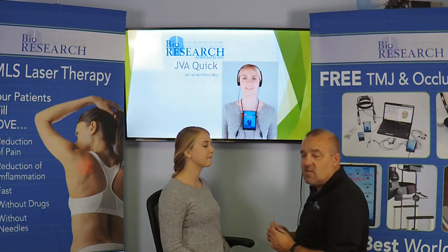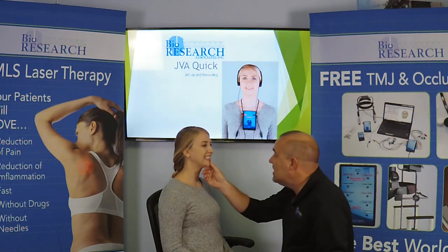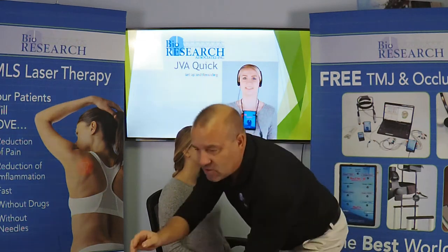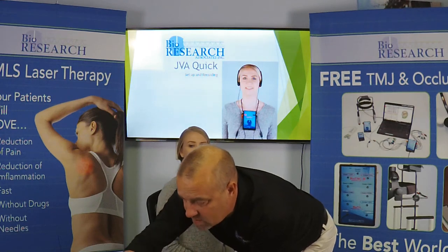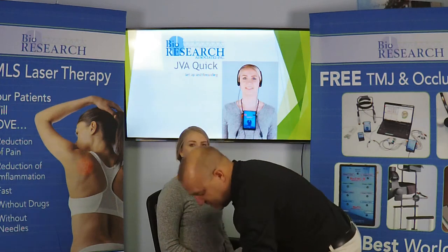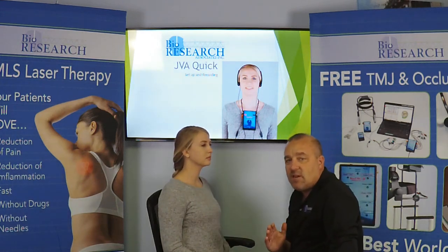Now, when we enter this number, we want to add the overbite or subtract an open bite. So bite, let me see her teeth. Okay, she's got about a 1 millimeter overbite. So I measured incisal edge to incisal edge of 62 plus 1 millimeter of overbite means her jaw is actually moving 63 millimeters. The next question is lateral deflection at maximum opening.